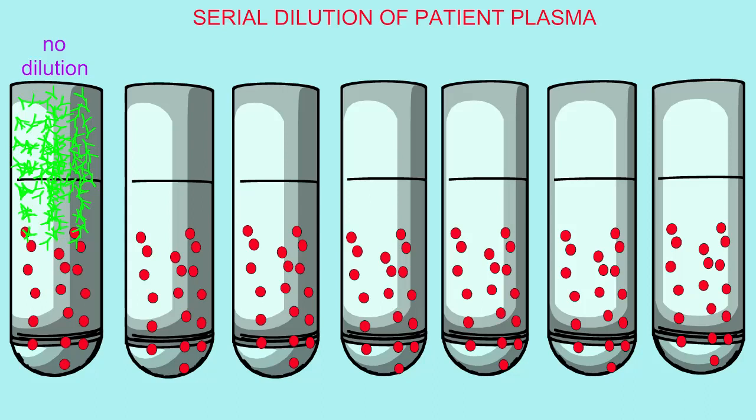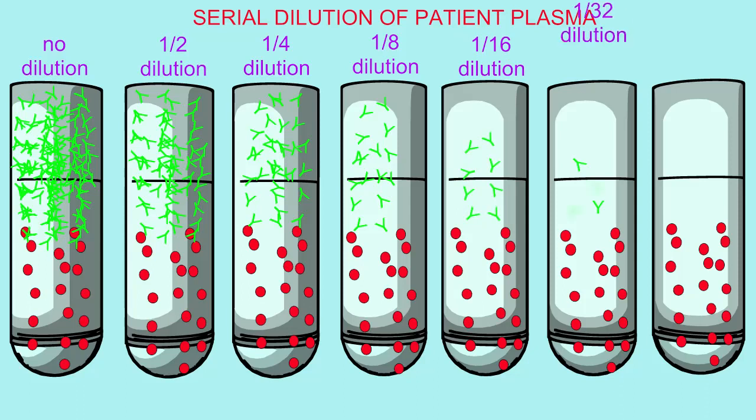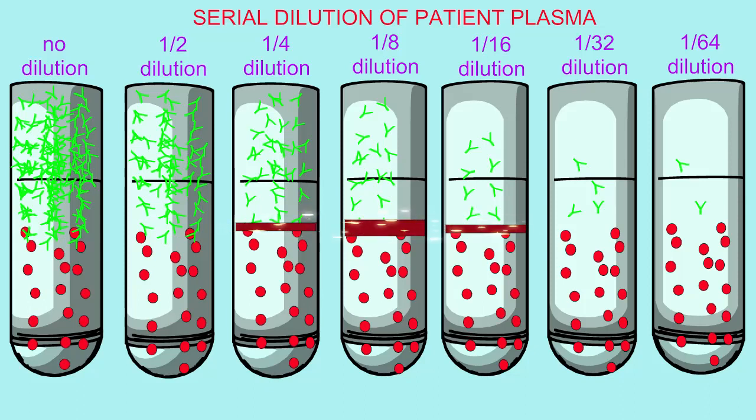they meet. Because of the excess of antibodies in this first tube, no reaction occurs, no precipitate forms. And so the serum can then be diluted by a 1:2 dilution to determine whether a zone of equivalence forms here. And a serial dilution of the patient's plasma can be performed, in which each tube has half the concentration as the tube previous. And at some point, precipitation may occur in a zone of equivalence if the patient is making antibodies against this specific substance.